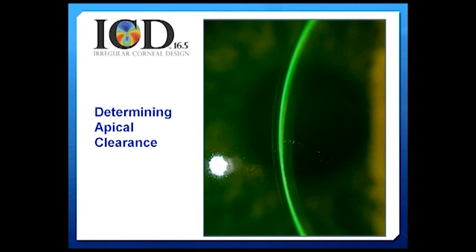Why so much fluid between the lens and cornea? Because we know from numerous studies, both in North America and in Australia, that scleral lenses settle by approximately 50 to 250 microns. So if you don't have enough fluid between lens and cornea, then that lens may settle into the cornea and actually land on the surface of corneal tissue, which we're trying to avoid.